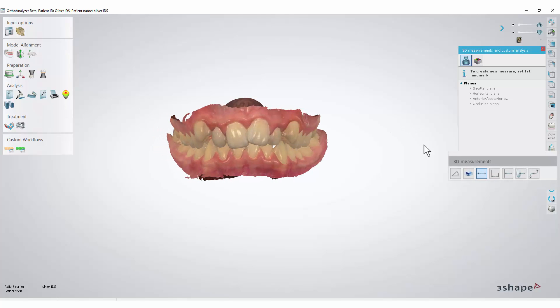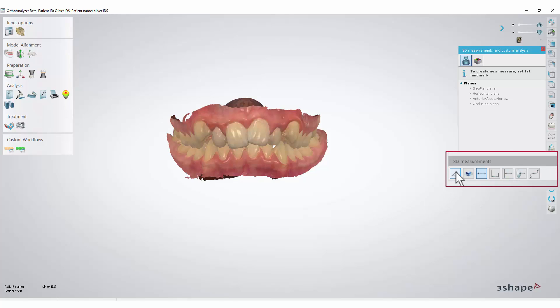To perform the measurements, select one of the icons at the bottom of the 3D measurements window. If you hover the mouse cursor over the icons, it will show you which kind of measurement will be performed.